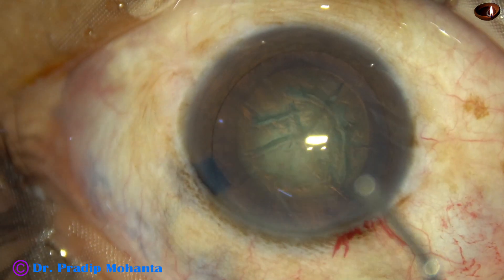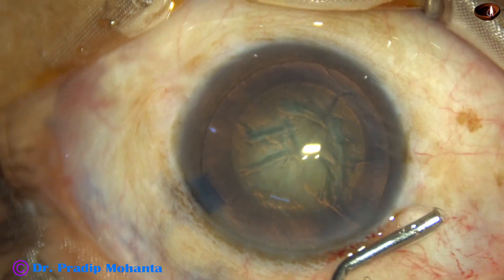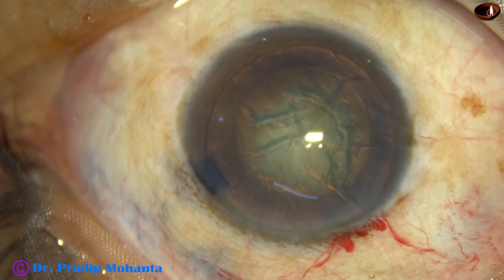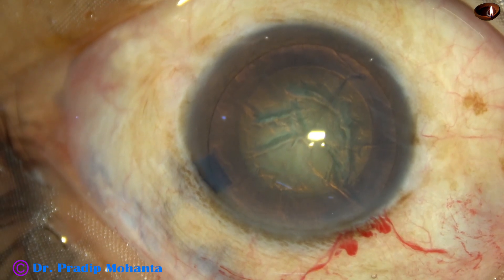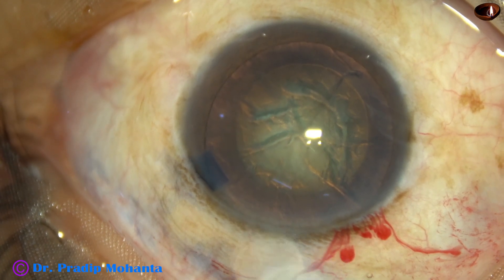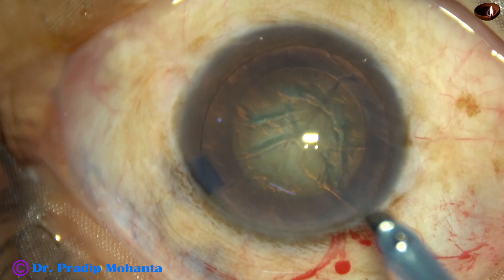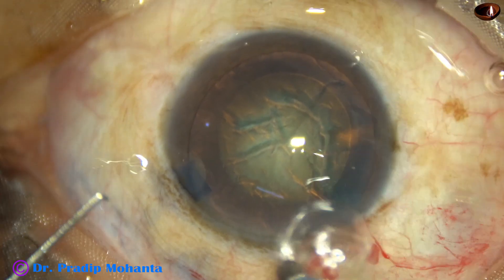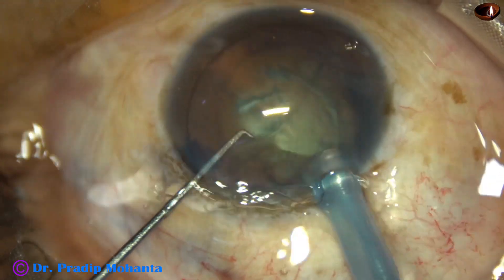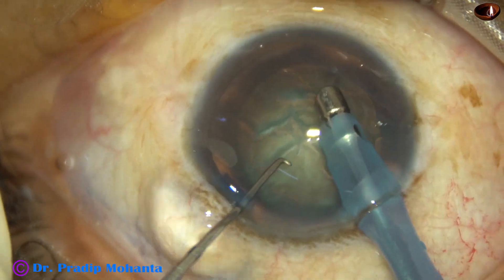In this case, my plan is to show the divide and conquer technique. The ultrasonic energy is about 60%, flow rate is 20%, and vacuum is 80% for sculpting. Ultrasonic energy depends on the hardness of the nucleus. This is a grade 3 nuclear sclerosis and 60% ultrasonic energy will be okay for this case.